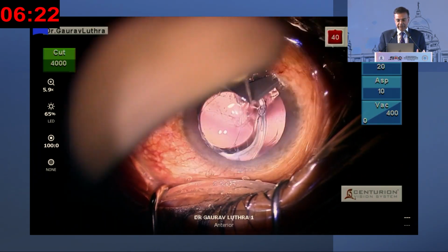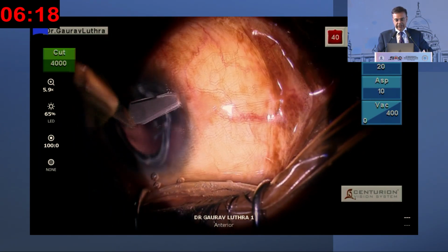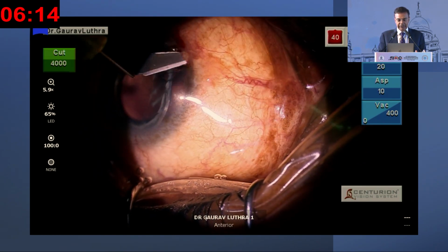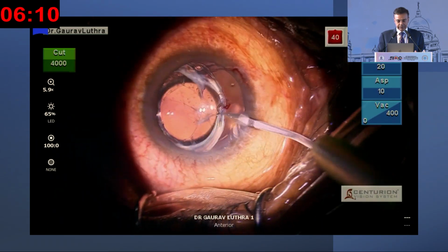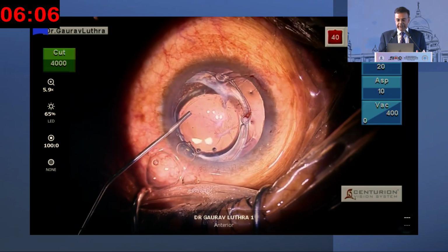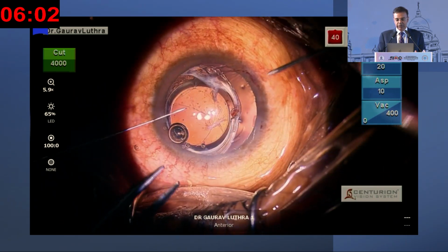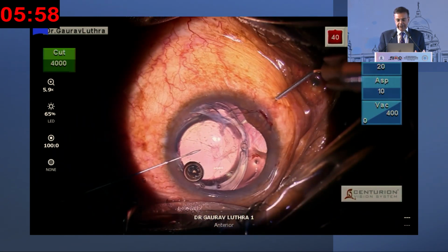So we are making a Hoffman's pocket. Wherever possible, I don't dissect the conjunctiva. I just make a small groove at the limbus and dissect a Hoffman's pocket. It's quite elegant and it's clean. And the idea was to pass a suture through the... So it's very easy if you have a CTR in the bag and the bag is fibrosed. All you have to do is pass a suture around the CTR and then anchor it to the sclera.